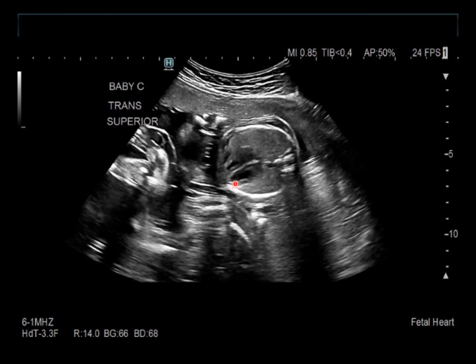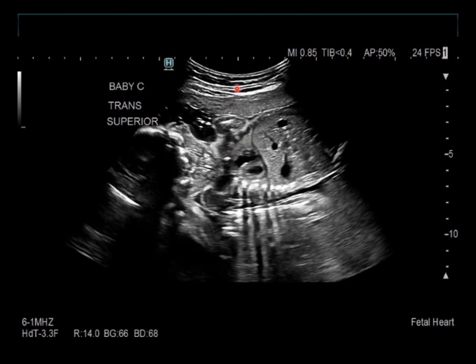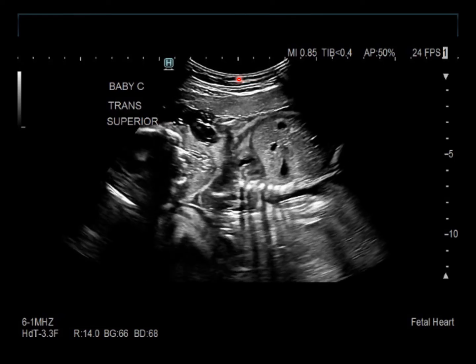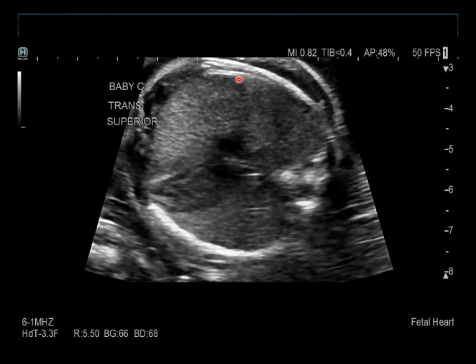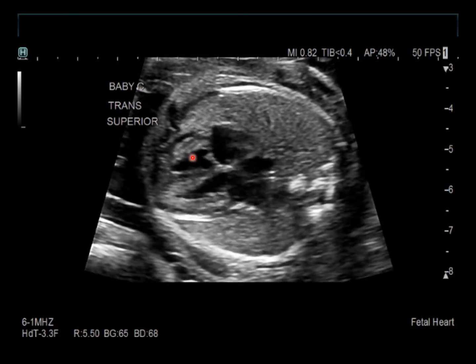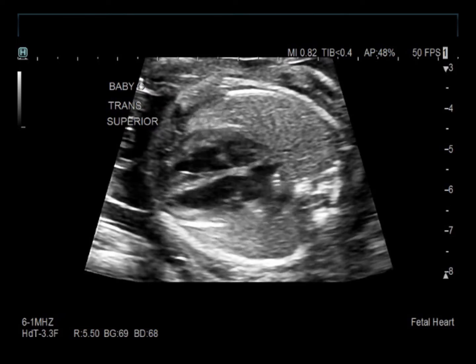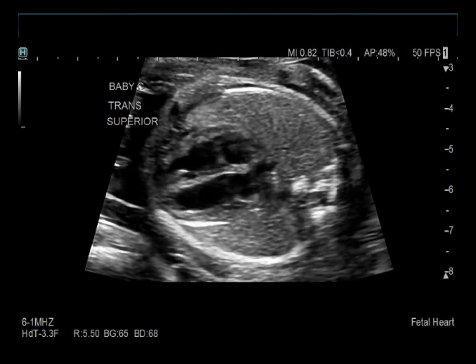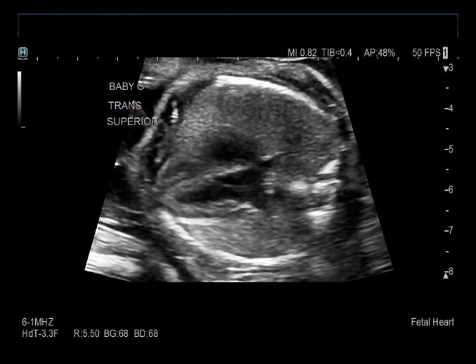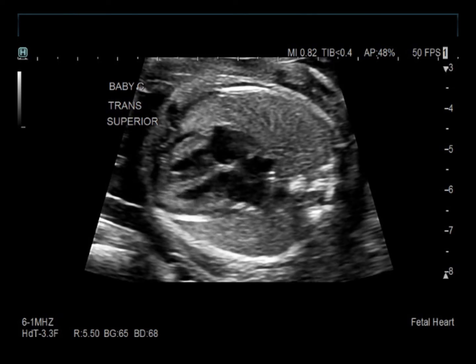And you can see the heart here. You can see the plane of the diaphragm. And so with that in the center of the sector, we will again turn back to our 4-chamber view. And this is the assessment we would do. Nice 4-chamber view, mid-thorax, levocardia, apex pointed to 5 o'clock. We would finish our scan on fetus C, and we would be completed with the triplet assessment.